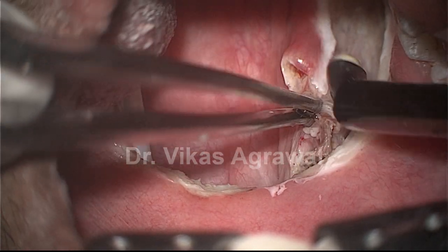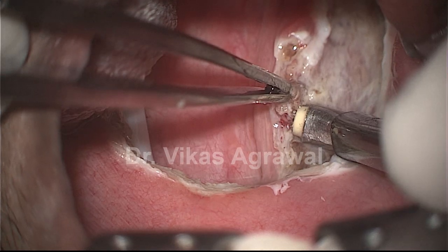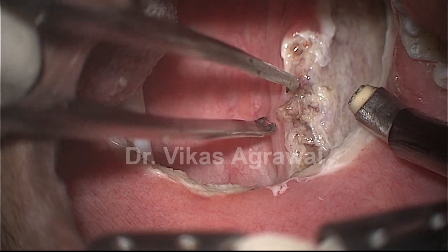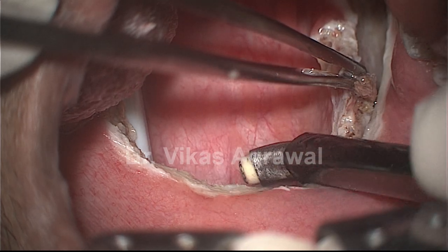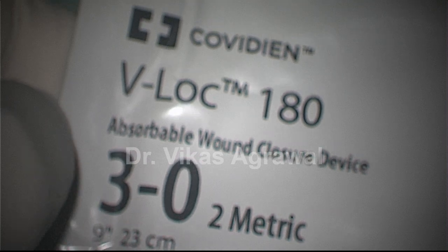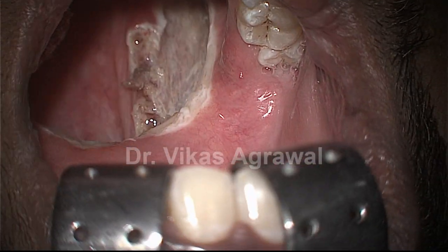I am going to transpose it laterally by barbed suture. Now this whole thing will be transposed laterally by the barbed suture. The barbed suture I am going to use is VLOC 3-0 from Covidien. I am going to suture it over the pterygomandibular raphe.